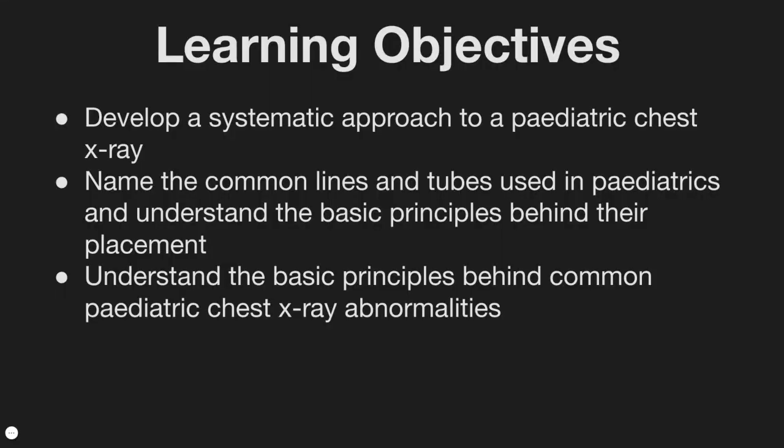Before we finish, let's return to our learning objectives. Hopefully you'll feel like you've made some progress towards all three of these. If you would like to look at more cases, then my best suggestion would be to search for pediatric chest x-rays on Radiopaedia and scroll to the playlist section, where there will be multiple playlists with both core and weird and wonderful abnormalities that you can work through in your own time.